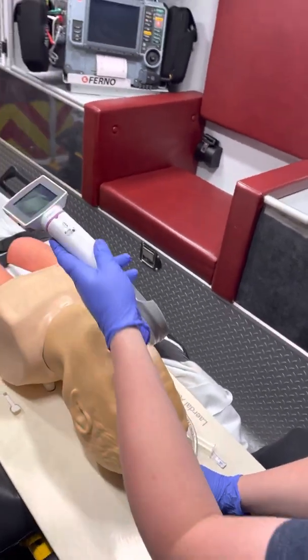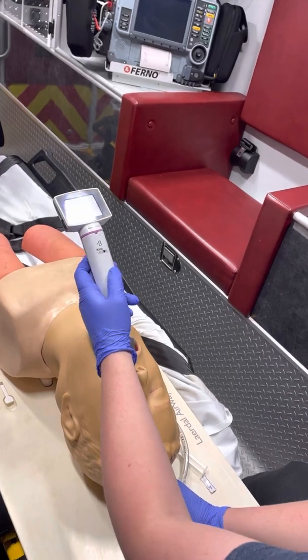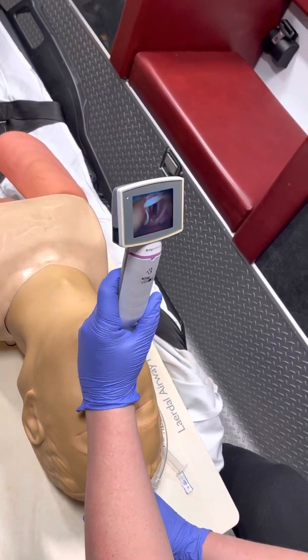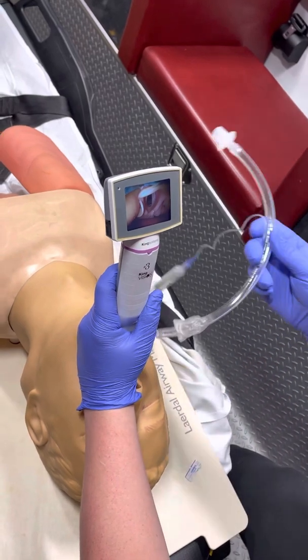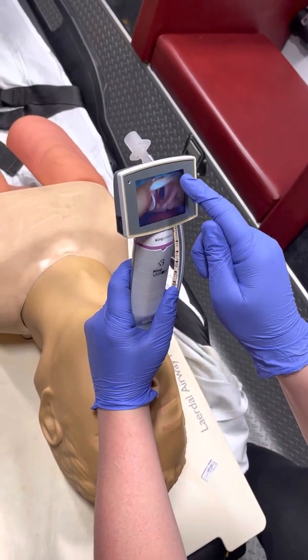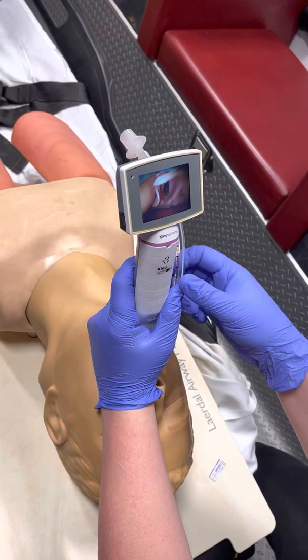You're going to put your patient in the sniffing position and insert the laryngoscope just like you would a curved blade, sitting it right behind the epiglottis in the vallecula — just like you would your Mac blade. From here you can slip your tube down the track, and you can see we have a really nice view: the epiglottis is lifted out of the way, vocal cords on each side, and a nice view of the glottic opening.